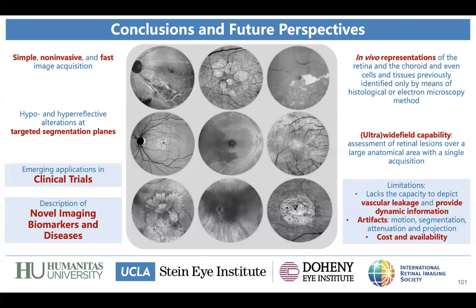So I totally agree with you in terms of advancements in technology. I mean, they will be the most important development, and in several points. First of all, in terms of speed. So how fast we can scan the retina of the patient. So this is very important in terms of cost and availability. So the more we use en face OCT across the globe, the more we are able to collect data, study new biomarkers. Of course, also in terms of segmentation. So we need a standardization.